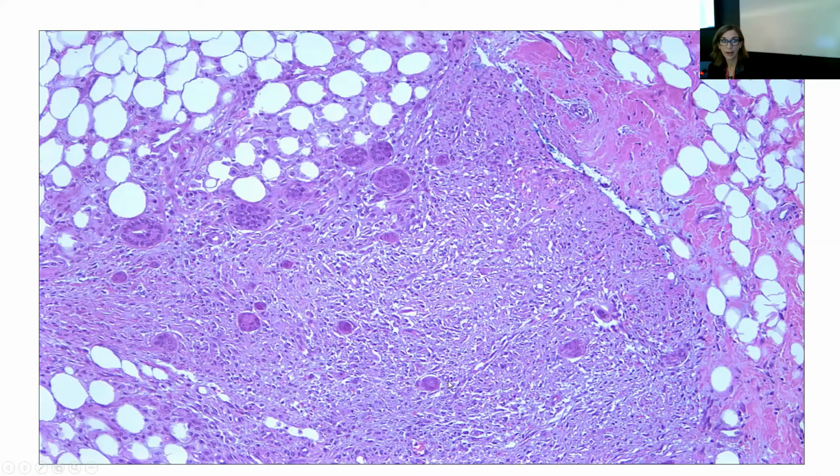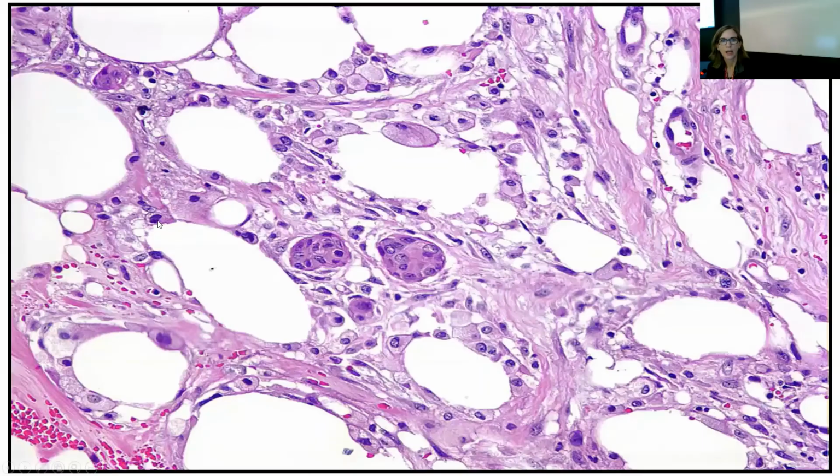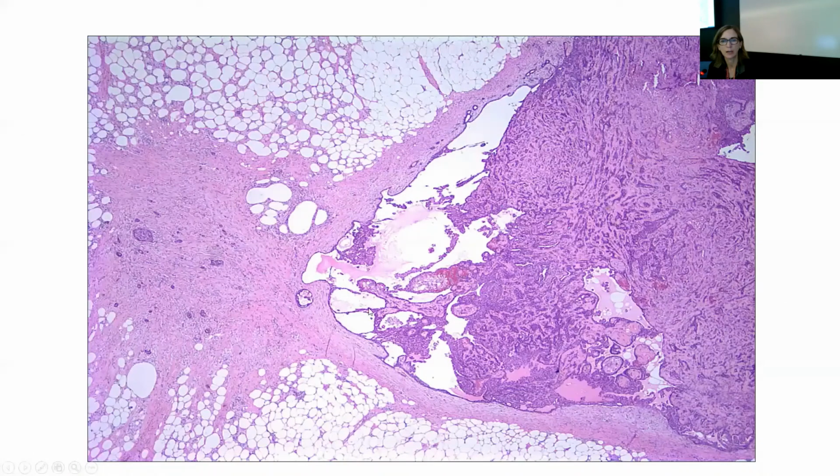They can look quite alarming, quite atypical sometimes. Even when the lesion that was biopsied was benign, they can look quite scary. Here's another case. And what happens is it tends to have this sort of sprayed look to it, where the epithelial elements are sort of shot out into the stroma. Here, just to show you, you can look for macrophages, you can look for hemosiderin to cue you into the fact that this is displaced epithelium.